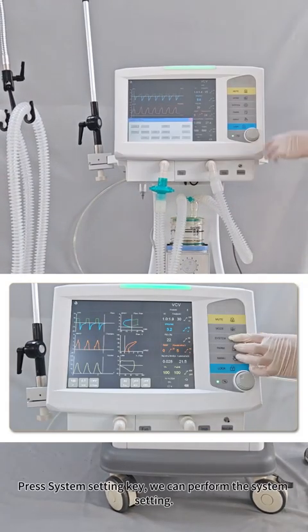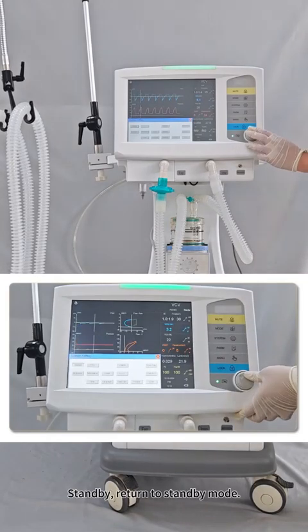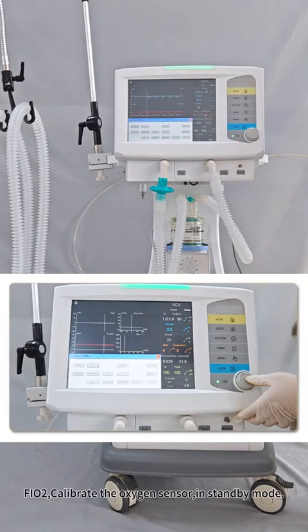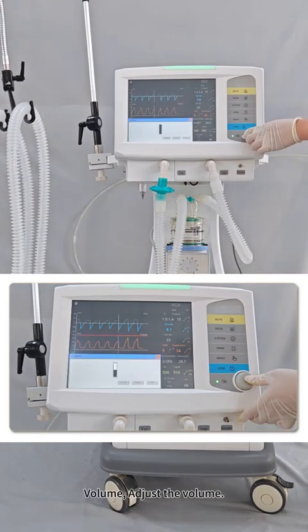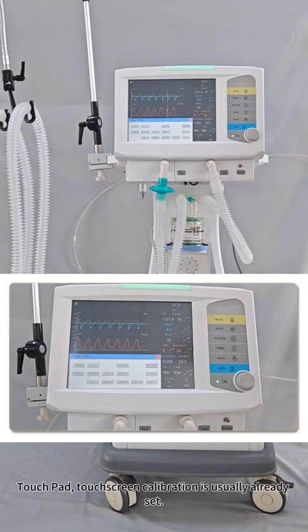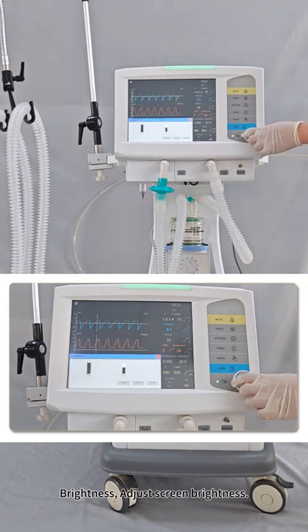Press the System Setting key, we can perform the system setting. Standby, return to standby mode. FiO2, calibrate the oxygen sensor, in standby mode. Volume, adjust the volume. Touchpad, touchscreen calibration is usually already set. Brightness, adjust screen and top light brightness.